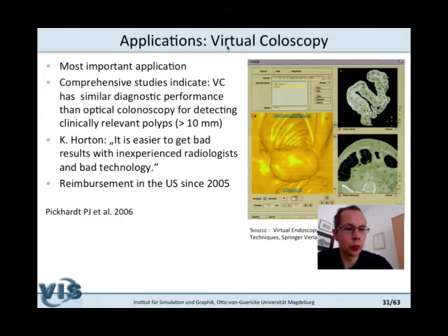And the last thing that we did was to think about the visualization techniques that are useful for virtual endoscopy. Real-time performance here is crucial. The user could not tolerate waiting several seconds or even fractions of seconds where nothing happens. On the other hand, good spatial relations are important.